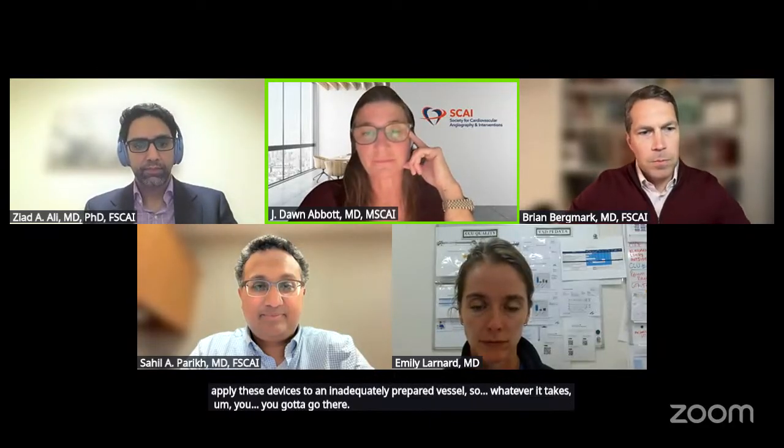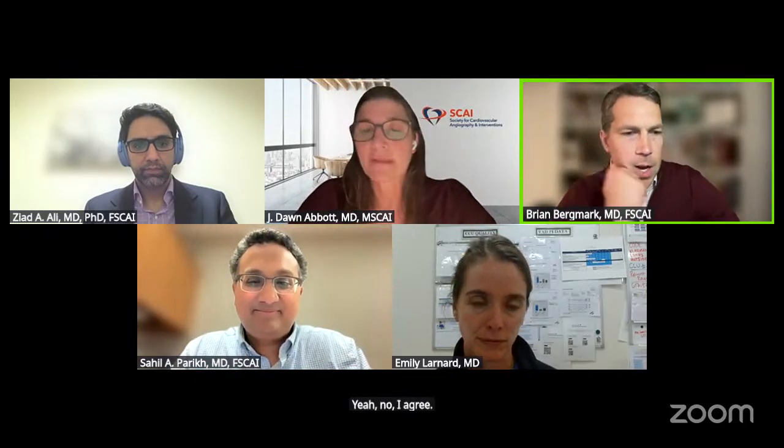Brian? Yeah, no, I agree. Thanks, Dawn. Our laser use has really dropped off. We'd like for it to ablate tissue when we use it, and there's just a lot of NIH, and you image it again, and it looks identical. It's not obviously less tissue in there, and so we have used it really just as an expansion tool.